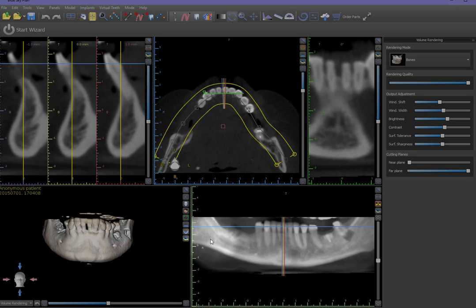The Panoramic image can be displayed in two forms: a composite view, which appears as a Panorex image, as well as a single-slice CT cut view.